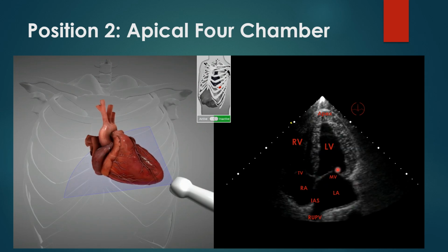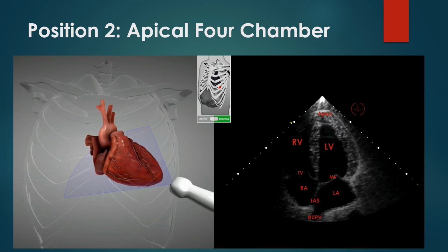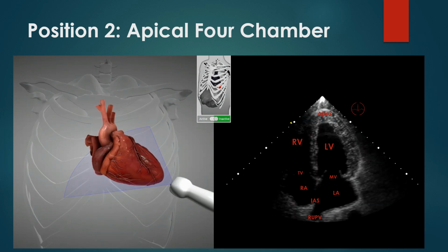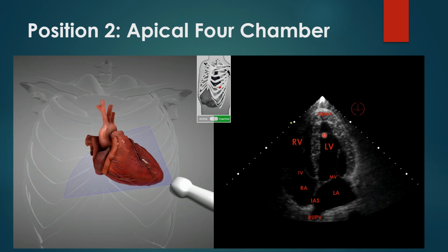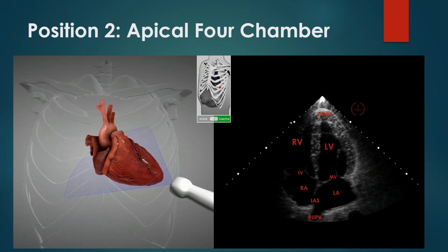So you can see the mitral valve there. You see the leaflets coapt very well, the tricuspid valve leaflets coapt. If I'm suspecting some type of bidirectional flow or MR or TR, I'm putting a little color on there, and I'm looking for it to be blue because the transducer's up here. The color is going to be blue back this way. And we'll look at some pathologies in the next presentation.